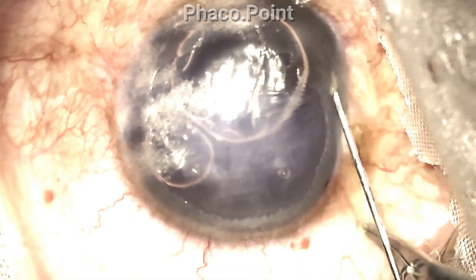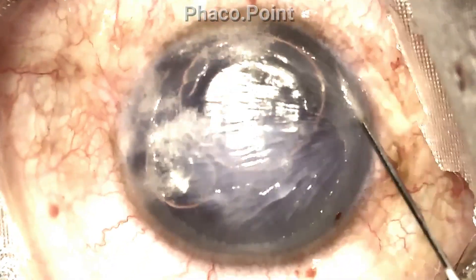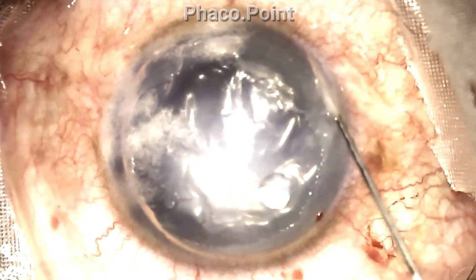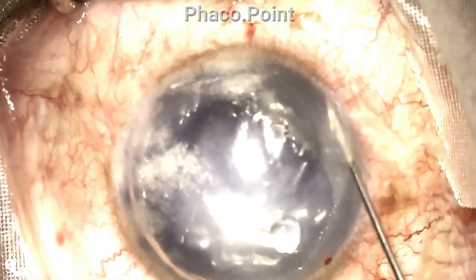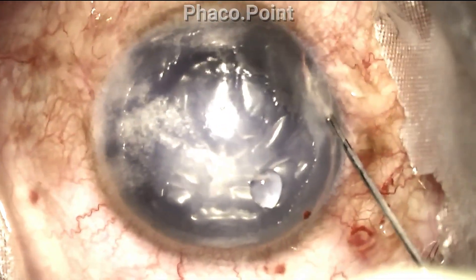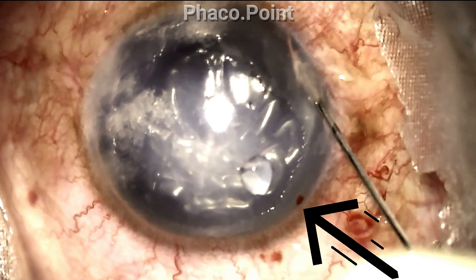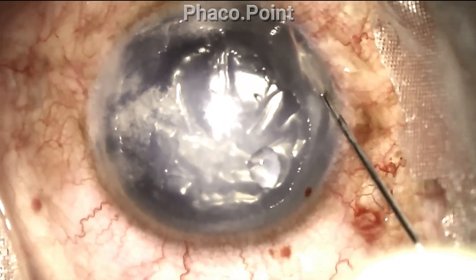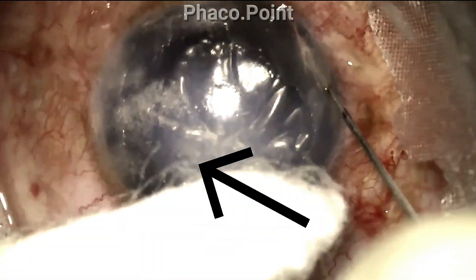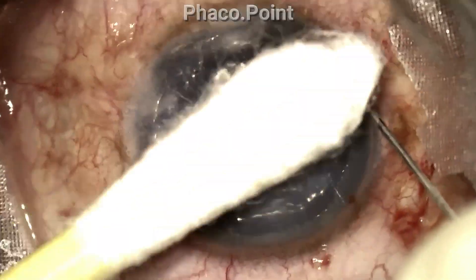We now proceed to the intracameral injection of this 14% C3F8 gas from another site. It's important not to re-inject from the initial port of entry, because a second injection at the same site prevents that entry wound from remaining self-sealing and you have a tendency to then lose gas. Note how where the venting incisions were made, fluid starts to come out — we've got a nice tight air fill which enables the fluid to come out through these venting incisions.